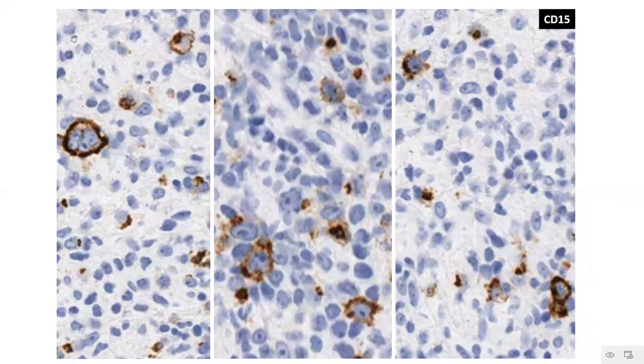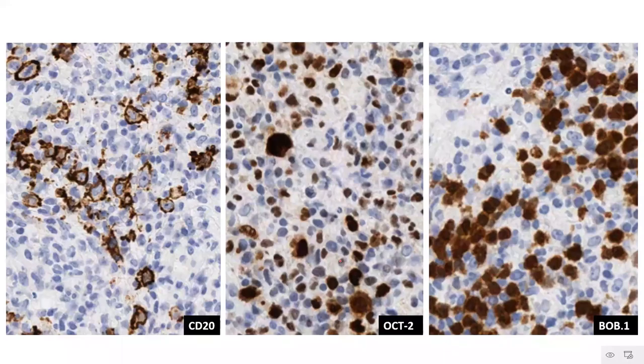CD15 shows you a nice positivity both in the membrane as well as in the paranuclear Golgi zone kind of pattern. Now, this pattern of expression would be very unusual in the case of primary mediastinal B-cell lymphoma. So that's one point in favor of classic Hodgkin lymphoma of the nodular sclerosis subtype. But now comes the problem. You do CD20, and in a case of classical Hodgkin lymphoma, you don't expect CD20 to be positive, right? But many of these cells seem to be showing expression of CD20.